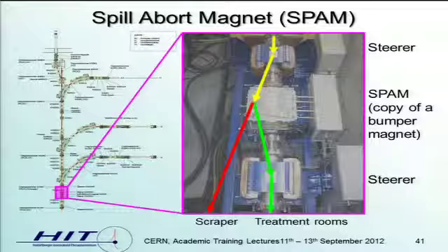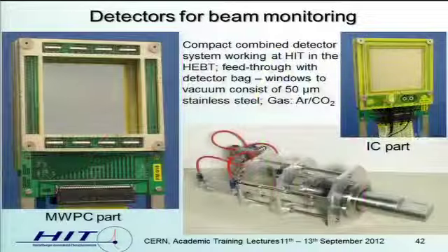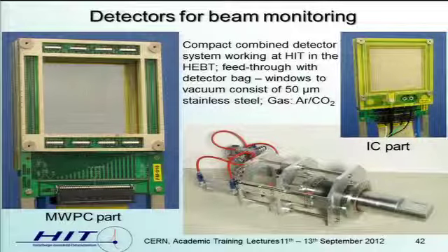Everything to shut down the beam here is less than 50 microseconds. Okay, and then we use detectors for beam monitoring. Just a short look at that.